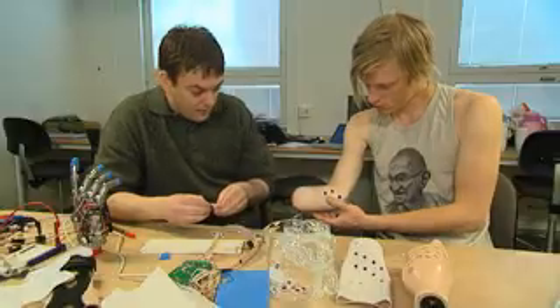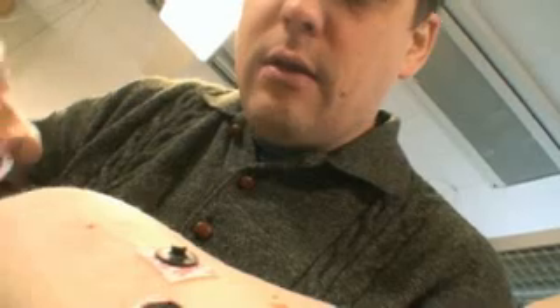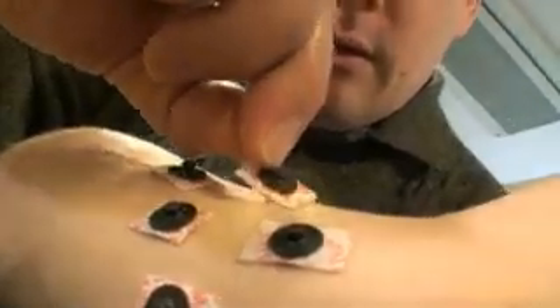In other words, if you put pressure on the index finger of the artificial hand, the index finger area of your brain will be activated. During the workshop, scientists are testing their latest prototype, which includes a sensory feedback system within the robotic hand.